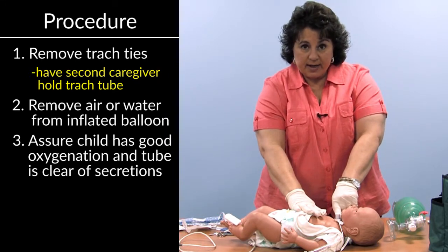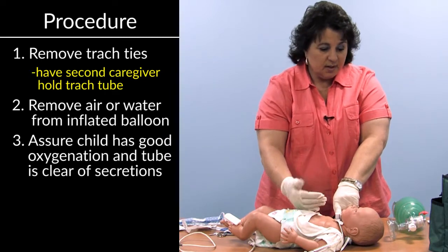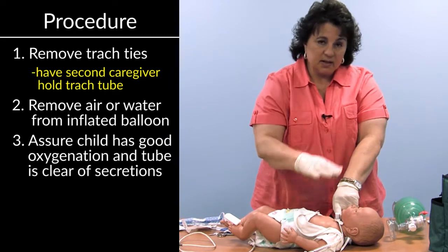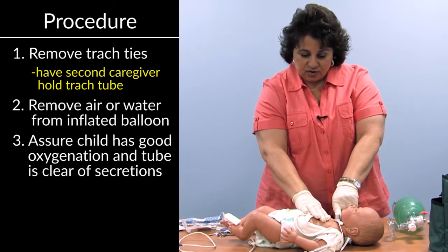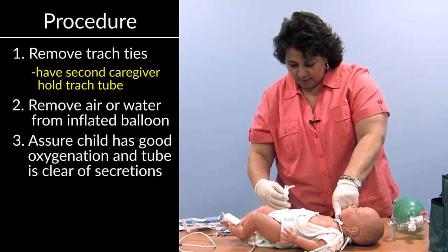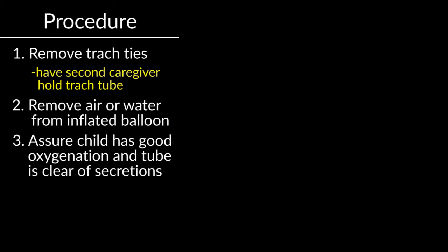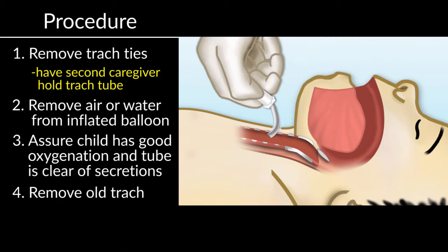The child is ready. If there are a lot of secretions that you feel or the child is coughing, you would want to pause and suction the tracheostomy tube to clear secretions before you change it. We will take the new tube, and the person that's removing it will tell them to remove it. They will remove it.